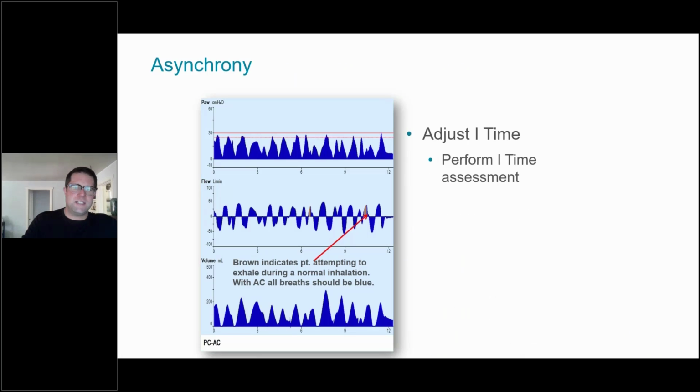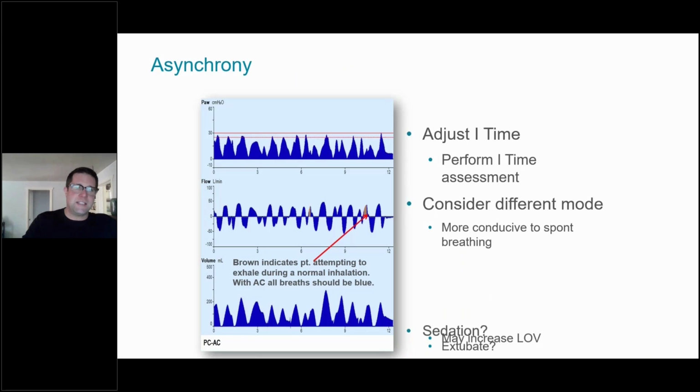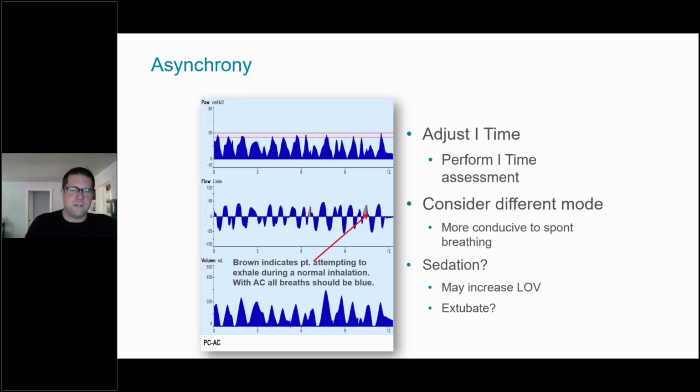And so dysynchrony really is an asynchrony or poor patient ventilator interaction, whatever you want to call it. Those aren't actually words you can find in the dictionary. Really, again, if we provide perfect synchrony with the patient, with the breath, then we will ultimately have to use less sedation and get them off the ventilator sooner, quicker. And so this is a patient who is obviously distressed.